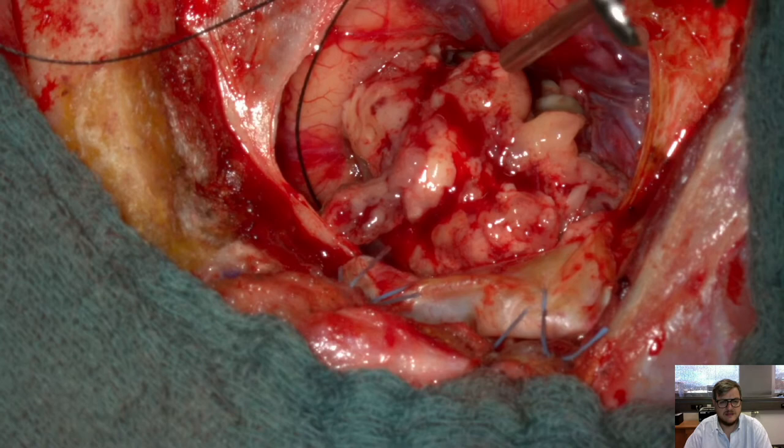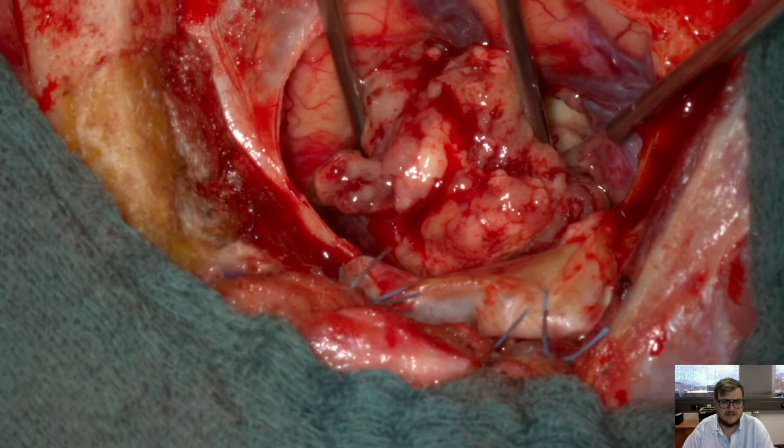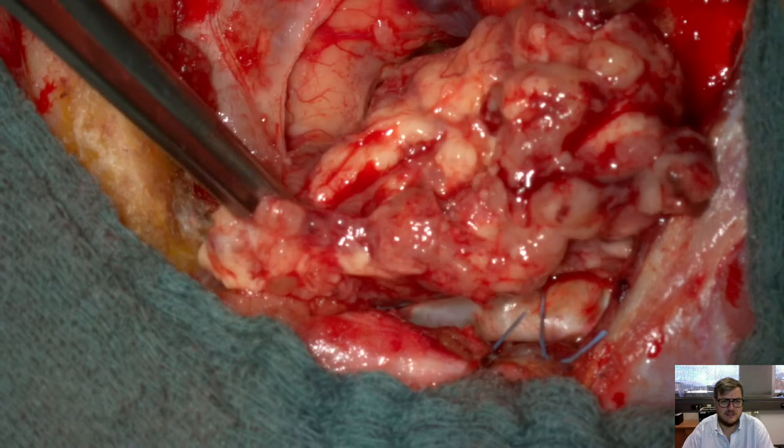Here you see the metastasis exposed. It's already circumferentially dissected. Let me show how we resect the remnants of the capsule from the more posterior part.